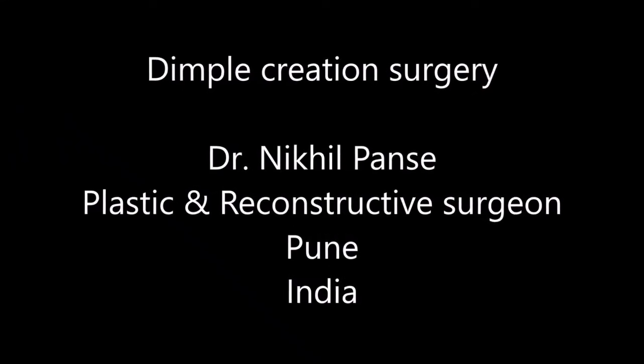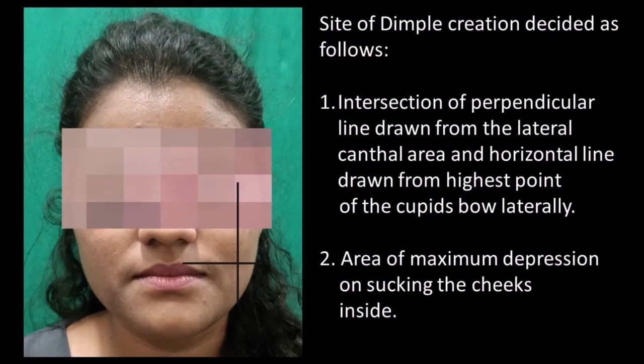So this video demonstrates the dimple creation surgery under local anesthesia. Now, generally, the site of the neodimple is at the intersection of a perpendicular line drawn from the lateral canthal area and a horizontal line drawn from the highest point of the cupid's bow laterally.